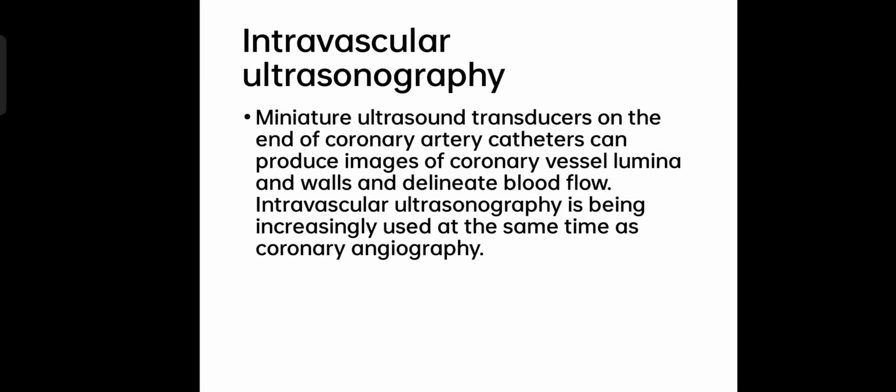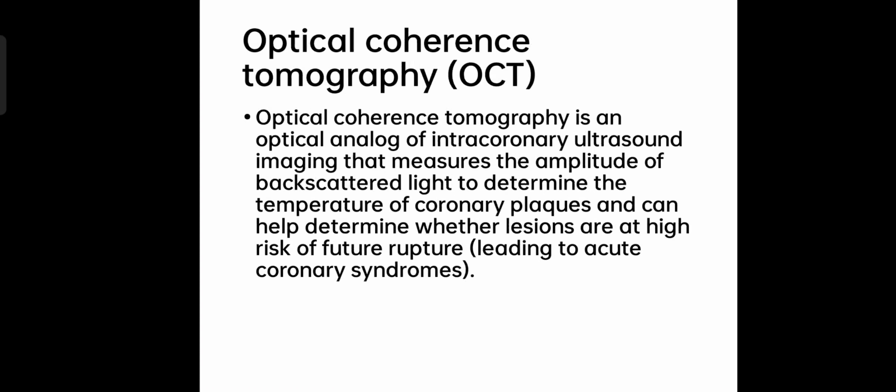Intravascular ultrasonography. A miniature ultrasound transducer on the end of a coronary artery catheter can produce images of coronary vessels, lumina, and walls and delineate blood flow. Intravascular ultrasonography is being increasingly used at the same time as coronary angiography.